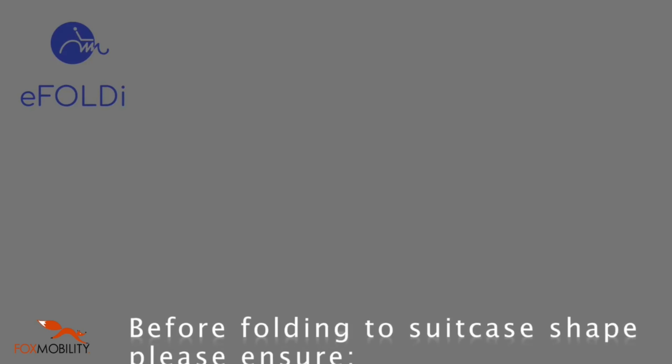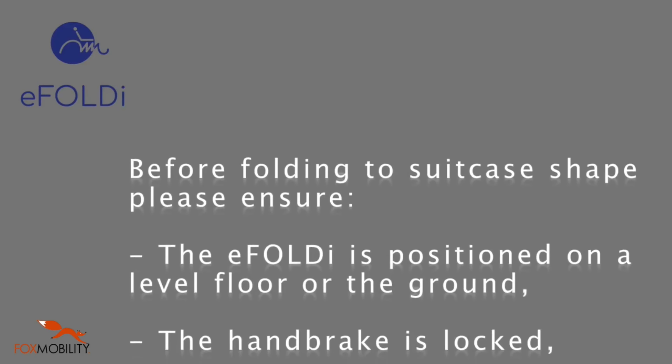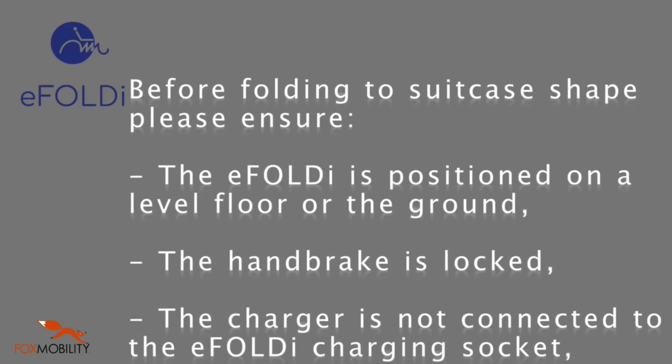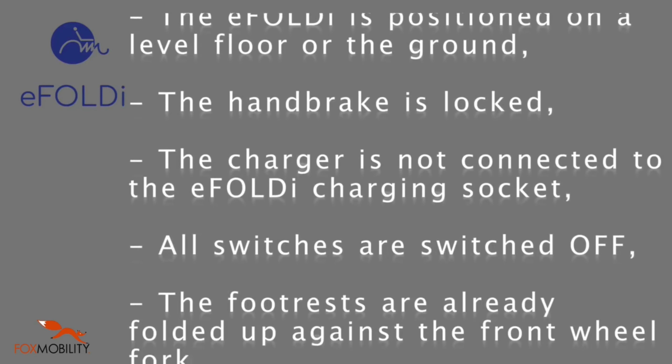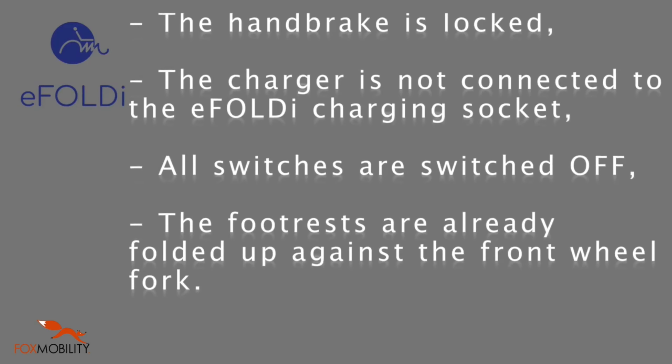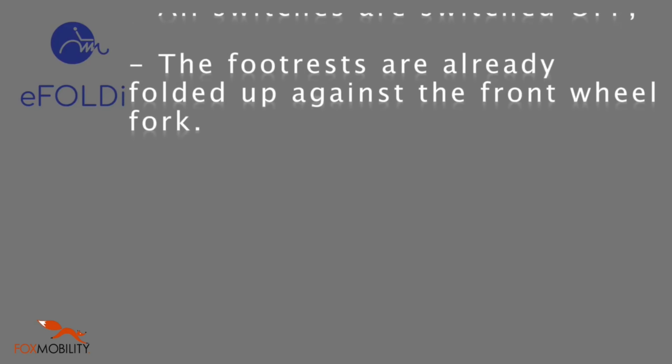Folding the eFoldie from a scooter to a suitcase. Before folding, please ensure the eFoldie is positioned on a level floor or ground. The handbrake is locked. The charger is not connected to the eFoldie charging socket. All switches are switched off. The foot rests are already folded up against the front wheel fork.